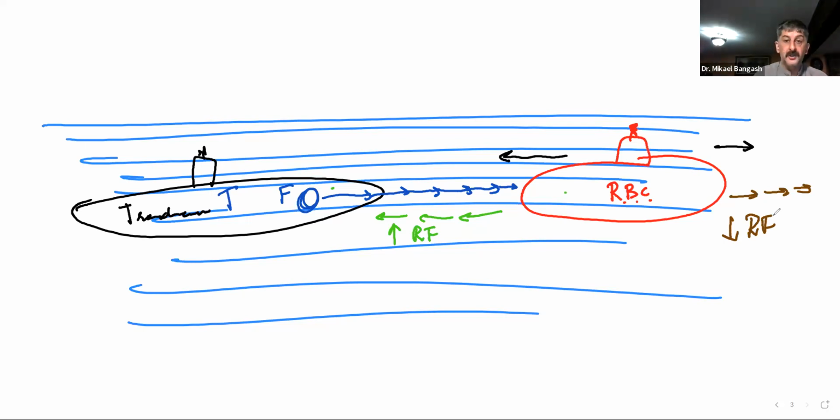So if you have watched any war movies or something like that, or even a documentary, you may hear the sound go deet, deet, deet, like that. Now, what does that mean? That the other submarine is approaching. Or you can say that the distance between the two submarines is decreasing. But here, one submarine was going to be your transducer. The other was going to be the reflector, which in the case of Doppler is going to be the red blood cell.